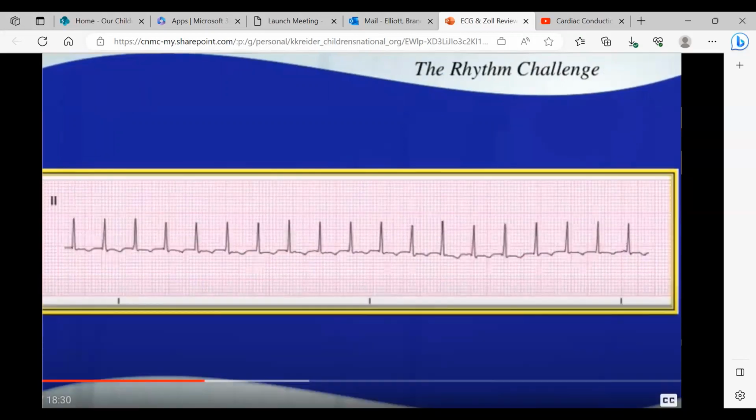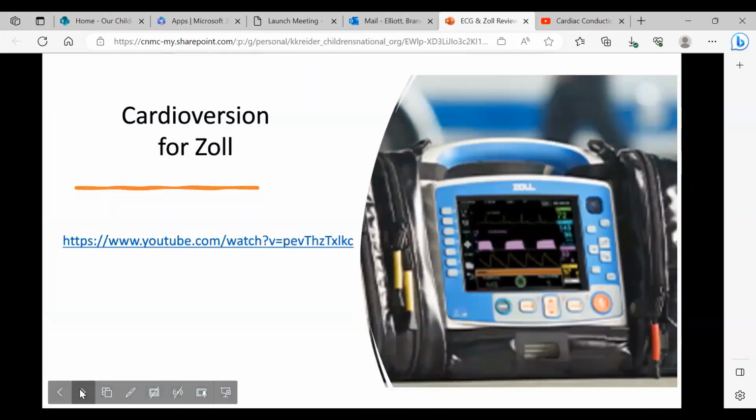And then my next victim, let's look at this rhythm as far as rate. Regular, irregular, and rate. It's regular, it's fast, it's narrow. I don't see necessarily definable P waves, so probably SVT. Excellent. I love how you described that. So SVT it is.